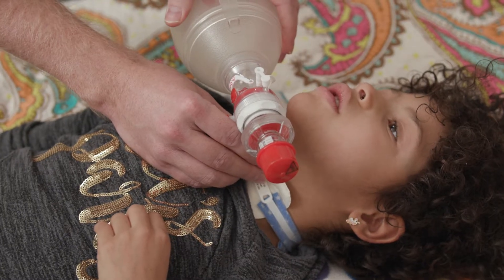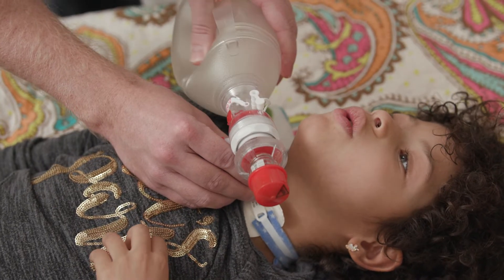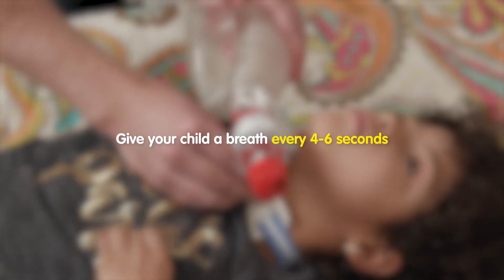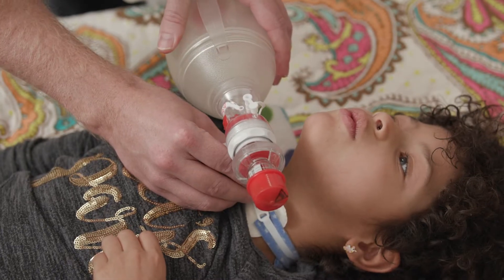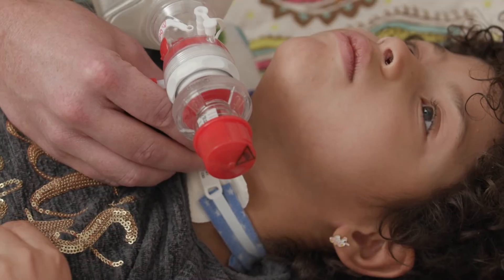Squeeze the resuscitation bag with slow and steady pressure so that you deliver the breath over about one second. Give your child a breath every four to six seconds. Count out one one thousand, two one thousand, and so on if you need help keeping pace.